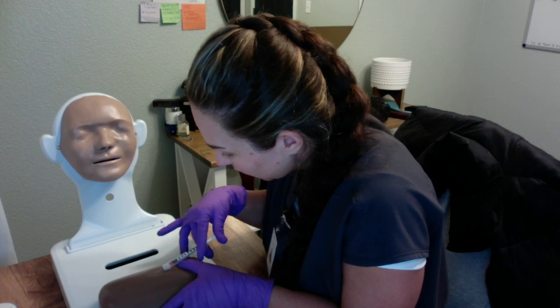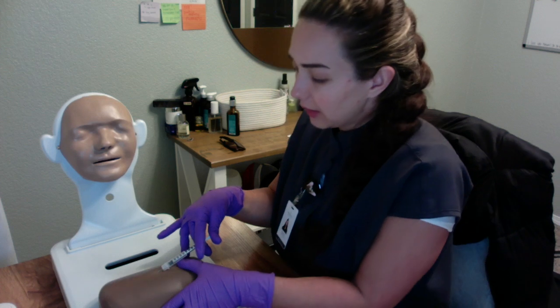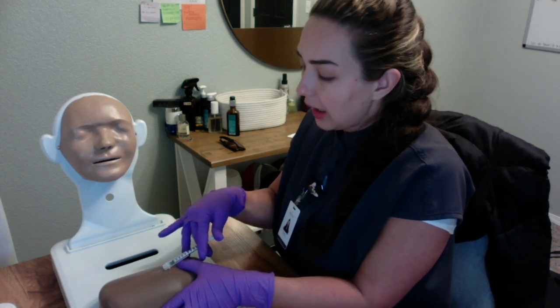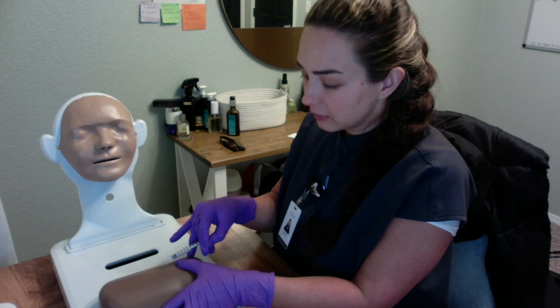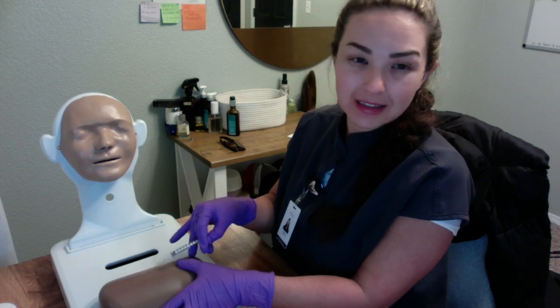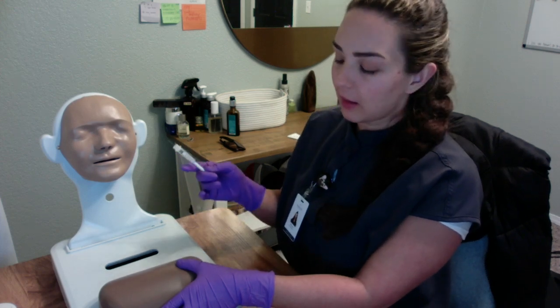Okay, and then we're going to slowly administer the medication. All right. And then we want to make sure that we can see a 6 to 10 millimeter bleb, what resembles a mosquito bite.